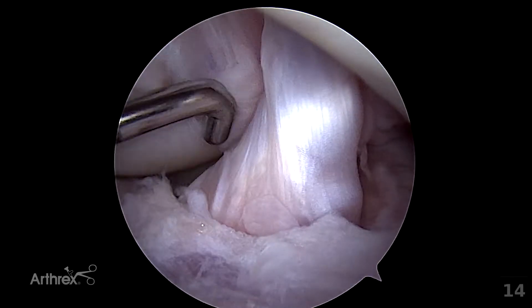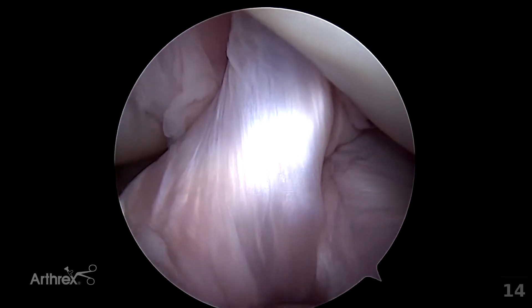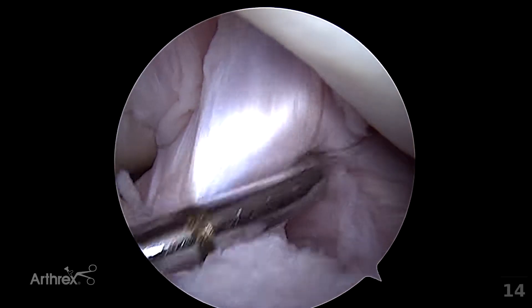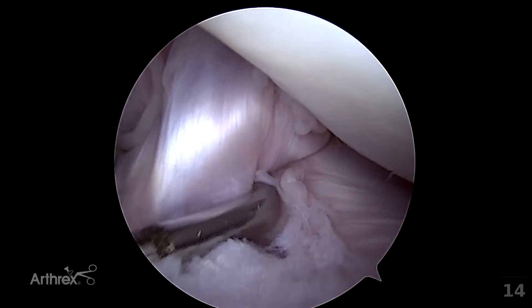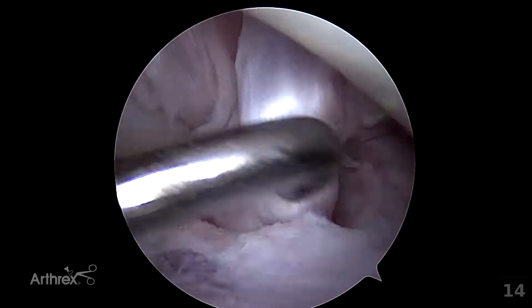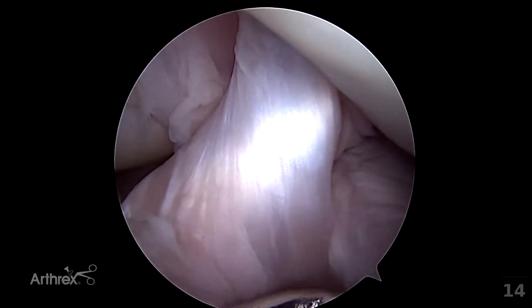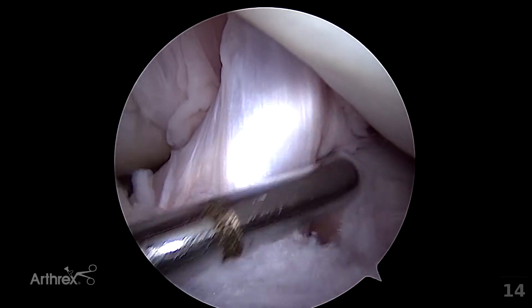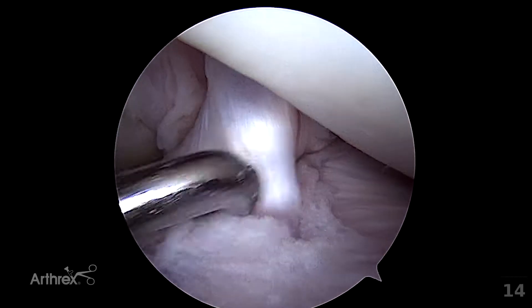In this anatomic specimen, this is a normal cranial cruciate ligament. The bands of the cranial cruciate ligament are seen wrapping around each other until they insert on the tibia. We will resect this cranial cruciate ligament next to allow full evaluation of the intra-articular structures.